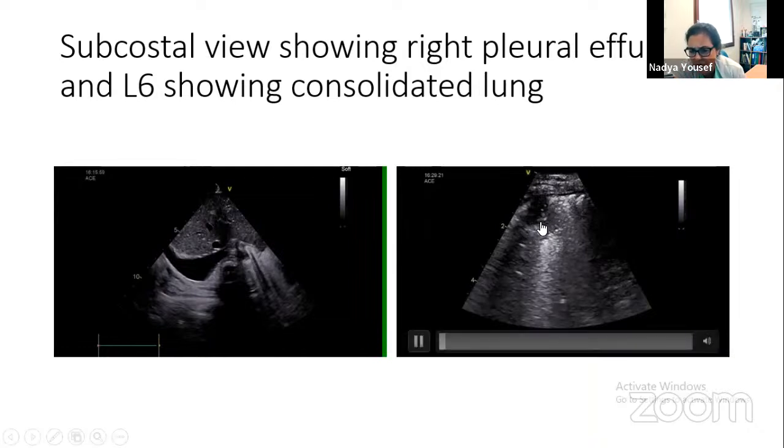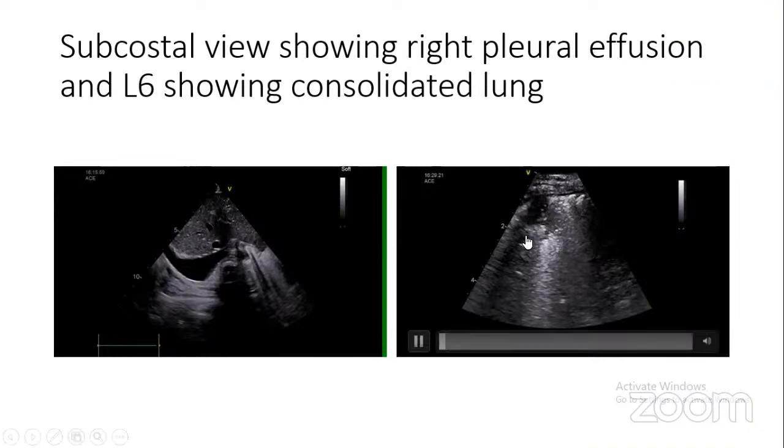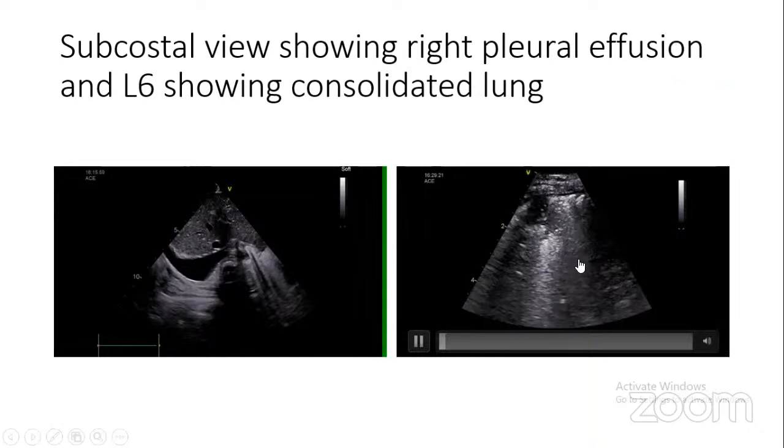Yeah, this is part of a consolidation where you have what might be like sub B lines that start off at the consolidation and not at the pleural line. Sharif is asking whether it's a shred sign. What do you think, Dr. Atnafou? I'm thinking hepatized lung rather than shred sign or other things, because this is a spleen. I'm sure this is a spleen because I'm right on the left side posteriorly. This is a spleen, and this is normally the pleural junction, but this is hepatized lung, solidified lung.